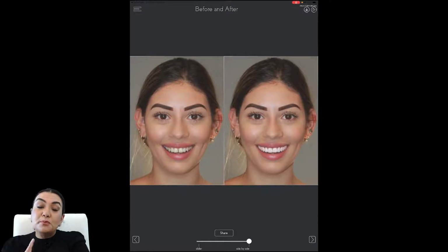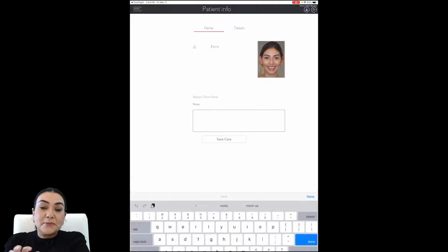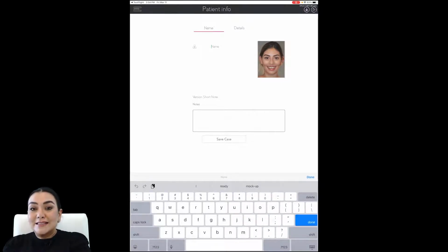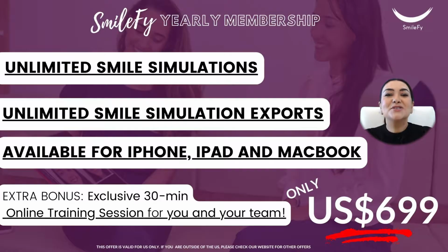You can do more than one option of smile for your patients so they can actually decide which one they want to take. After you do that, you're safe and you're going to be ready to finalize it and to finalize the negotiation with your patient. What is your next step? Get the yearly membership. So you're going to have unlimited smile designs.